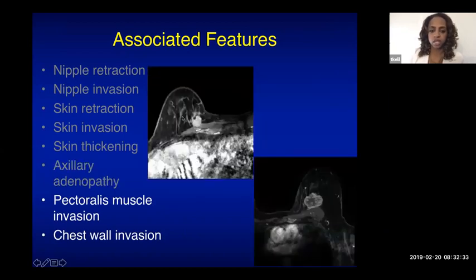And you also want to mention, like I mentioned at the beginning, if there's any pectoralis muscle or chest wall invasion, because that would change the management options that the patient might have. So you want to look for that and report that.